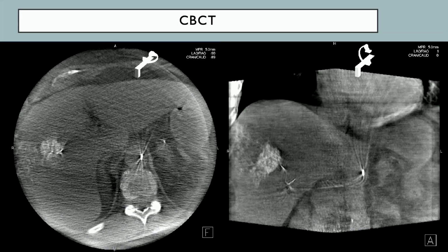So anyway, here, obviously no surprises, we went for a Y90. I'm not showing you all the images. We started with a more general cone beam of the whole liver, and then we did a more selective cone beam. I think you truncated some of the images. I did. There was a single feeder that we thought was supplying the tumor. What I do is the angio initially, then the cone beam, and then we go selective, exactly the same approach that Tyler uses. You're showing the more selective cone beam, showing complete coverage of the tumor and the segments involved. And then MAA.